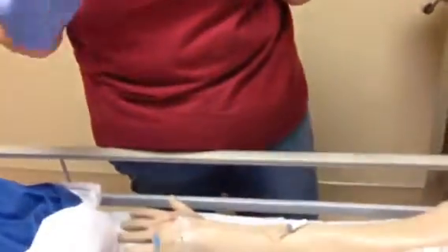Now, if you had fluids going, you would be able to tell that just by looking at your IV, because you've already got fluids going in there. If you're not sure if your fluids would mix with your medicine, it's always a good idea to flush before and then to flush after to make sure about the compatibility.